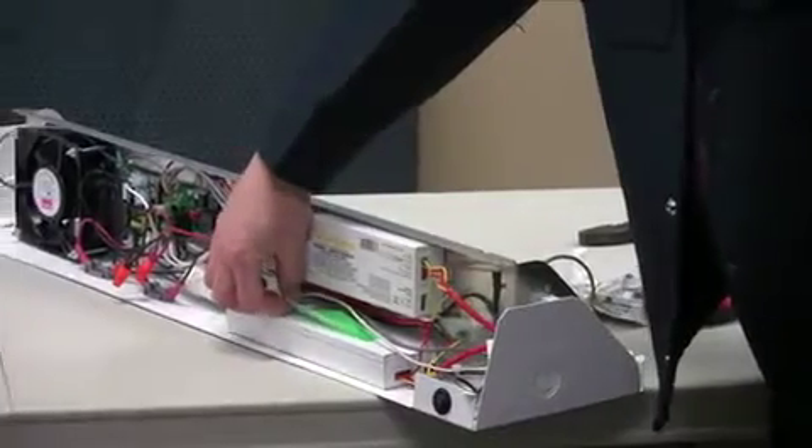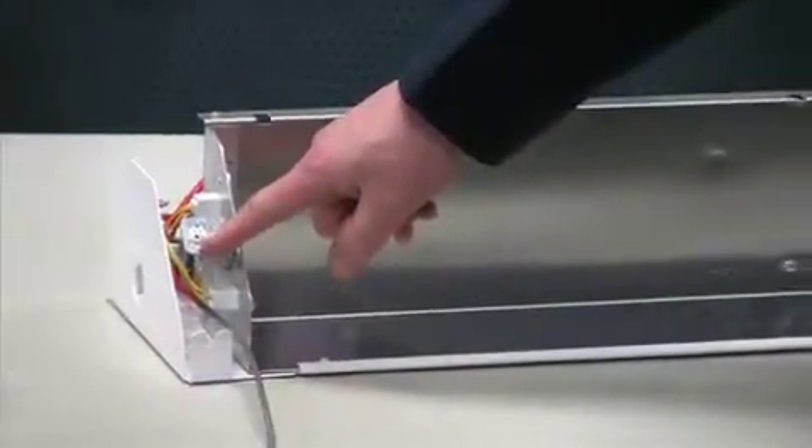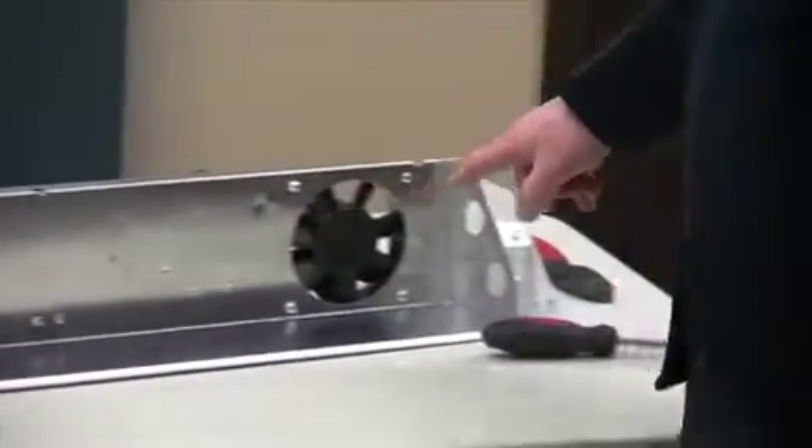Note that the motion detectors are included in a ziplock bag over the ballast. They will be used at a later time. Note the position of both motion detectors that will be installed later.